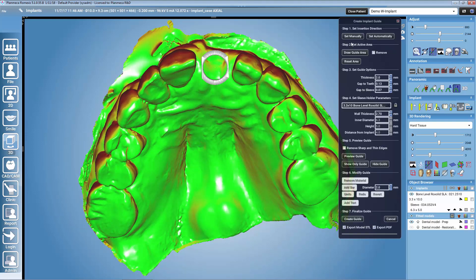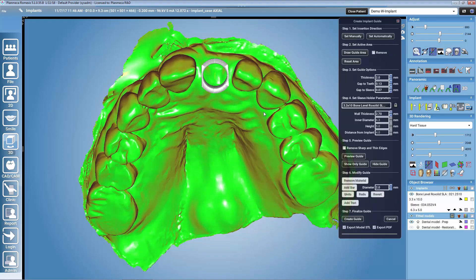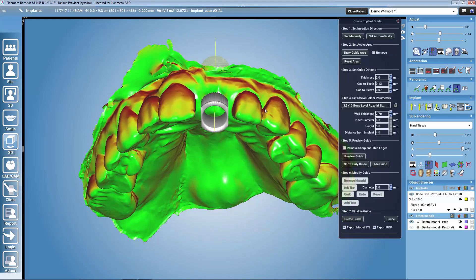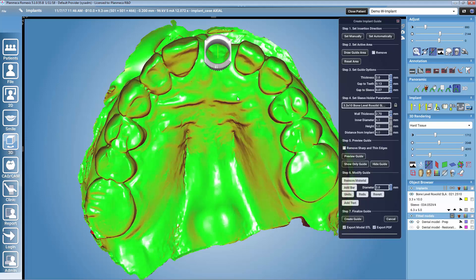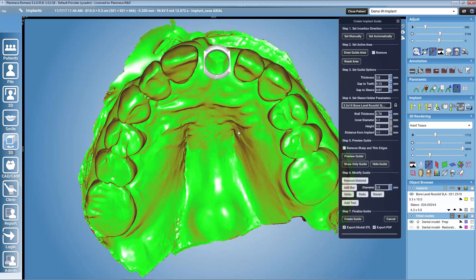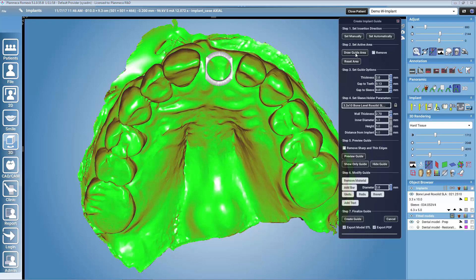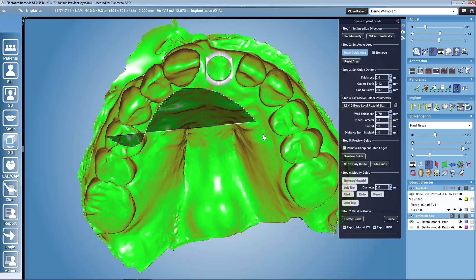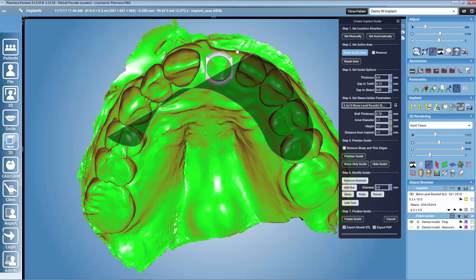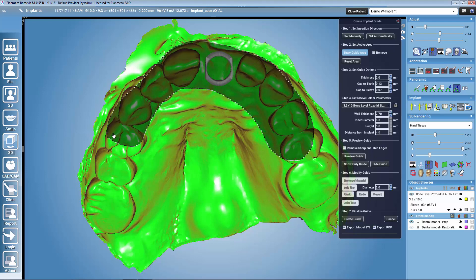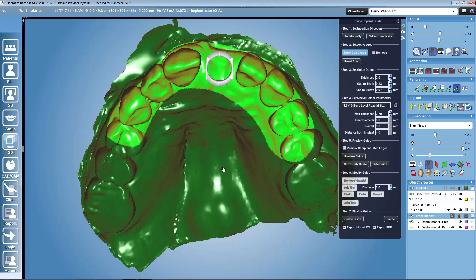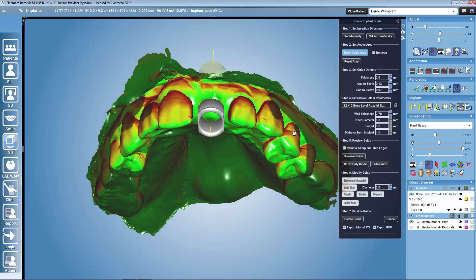The contact points are the green areas and the red areas are undercuts. I want to rotate the model and click set manually from the viewpoint of my insertion direction, and check that I have green areas both buccally and lingually. The second step is to draw the guide area. With mouse left click we select the area that we want to create the guide onto, and with mouse right click we can remove areas.